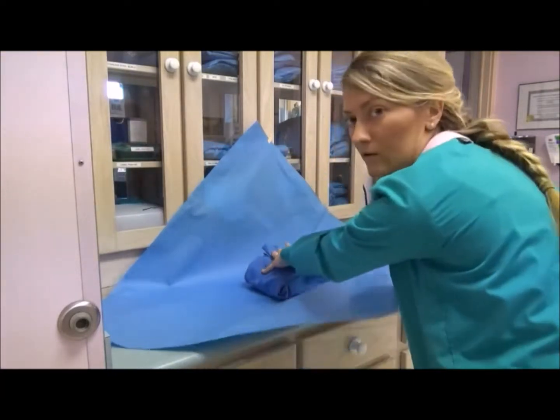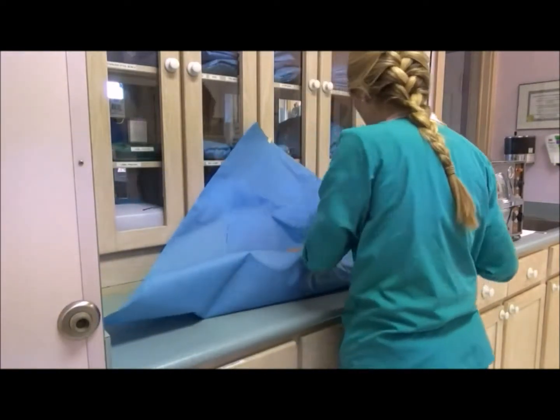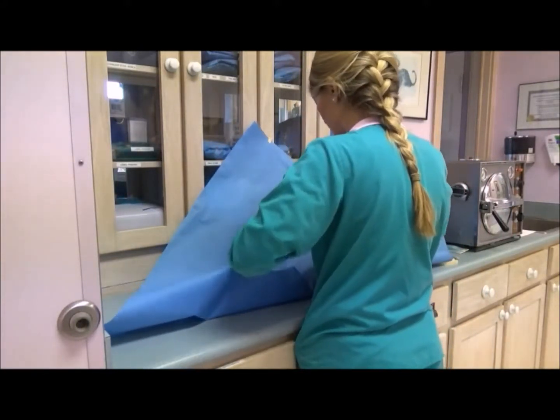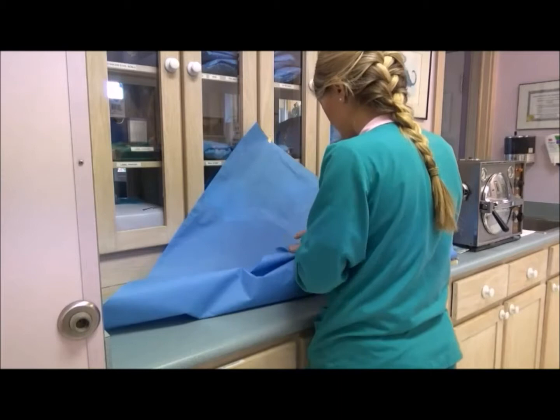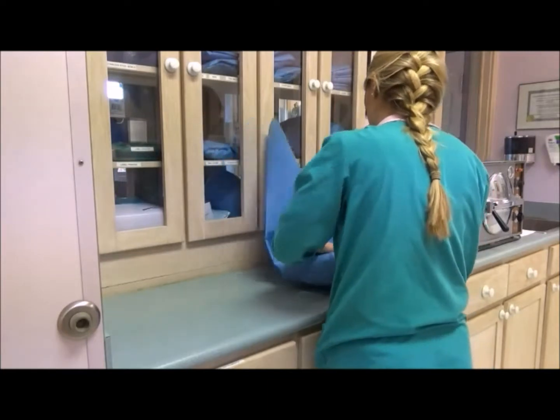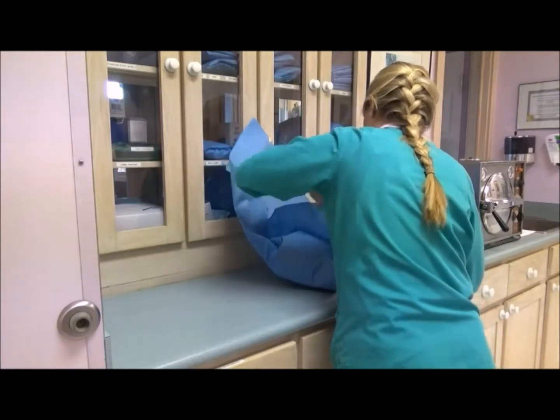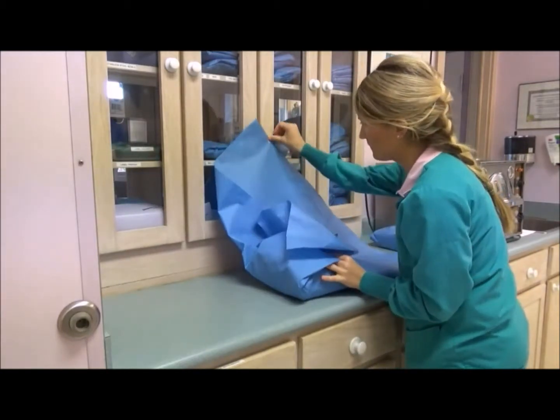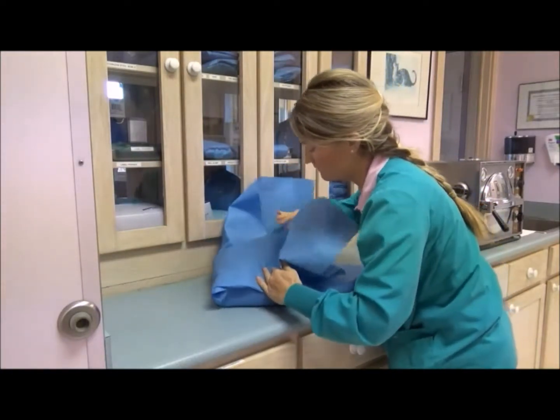And now I'm good to use the angled wrapping method to finish wrapping the gown here. Get it nice and tight here.